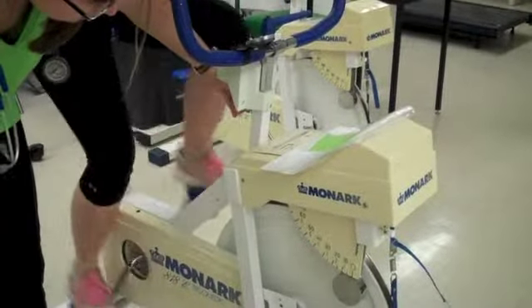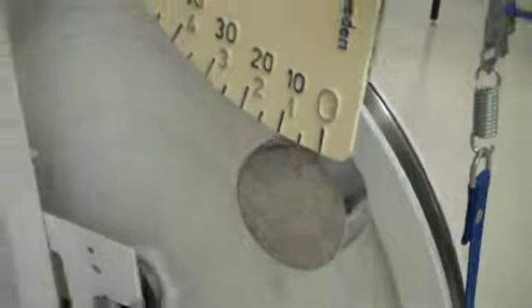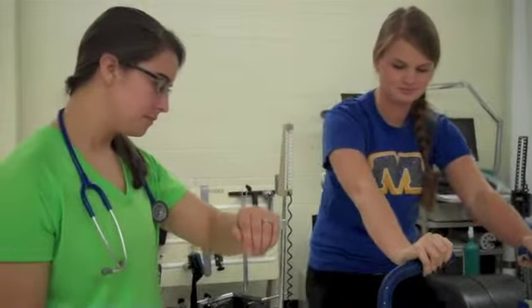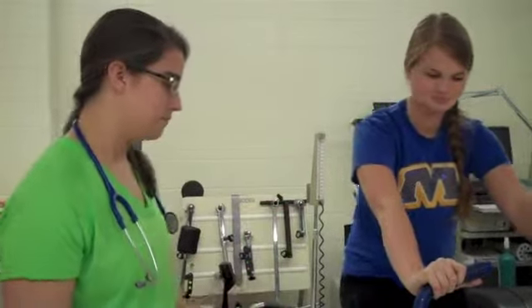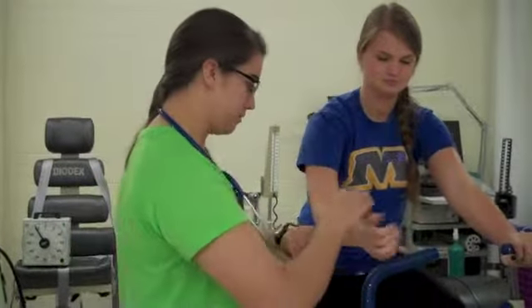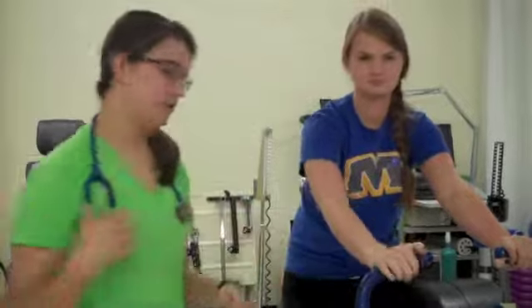Just keep cycling there. You can see here that we are at 0.5 kilograms for the first stage. So Ashley, in 1 minute, I'm going to take your heart rate and see where we're at. Just keep pedaling. In 15 more seconds, I'll take a heart rate. Ashley's heart rate right now is at 92, and she still has 2 more minutes left of this stage.